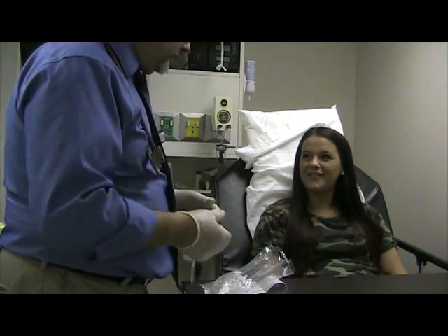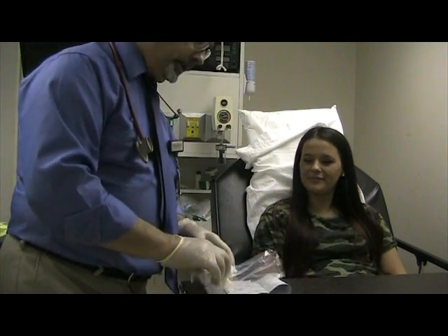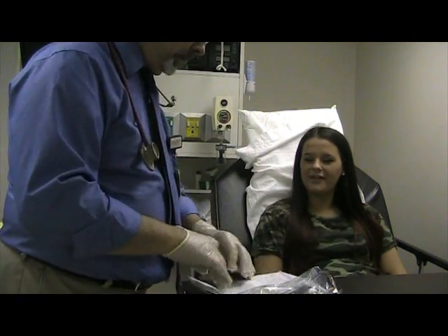I am going to teach you a little bit about breathing deep, keeping your lungs active, helping open those airways. And we're going to use a device called an inspiratory threshold trainer.